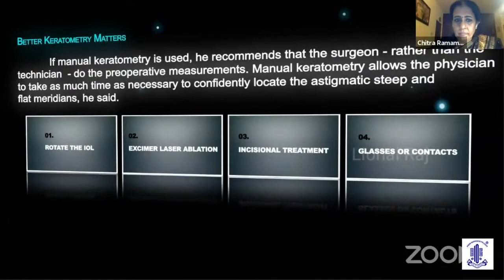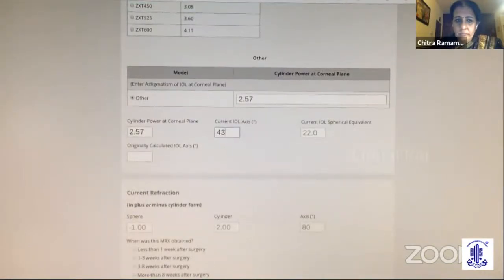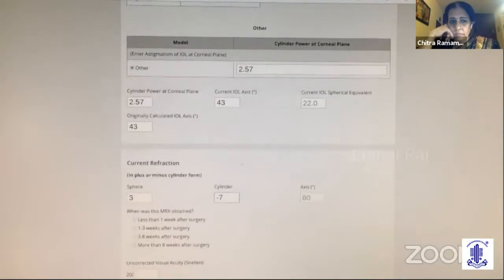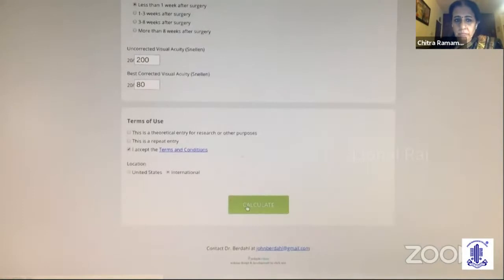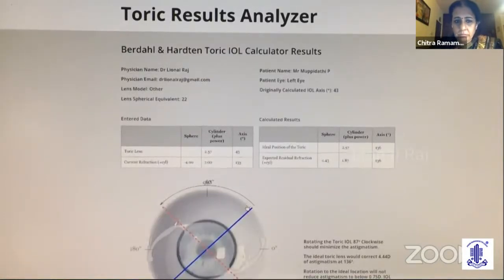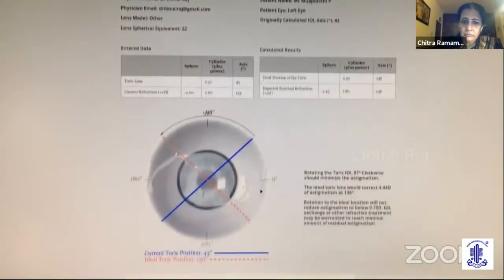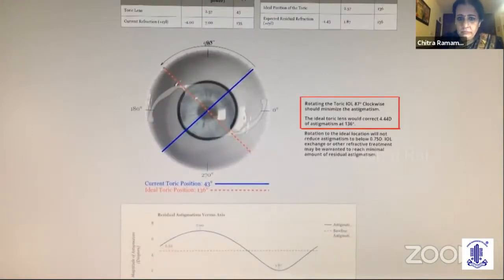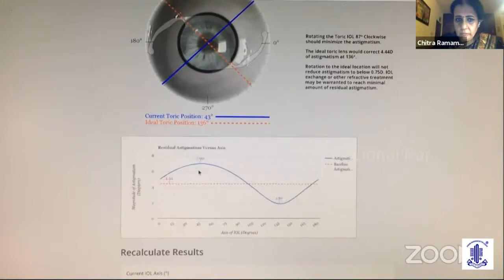The options left for me were rotating the IOL or exchange of IOL. I proceeded to rotate. An online toric results analyzer was used. After marking the originally placed IOL parameters and the amount of refractive residue, the results were obtained. Rotating the toric IOL 87 degrees clockwise to a newer axis of 136 degrees was expected to correct up to 4.5 diopters of astigmatism, with a residual 1.87 diopters of astigmatism anticipated.